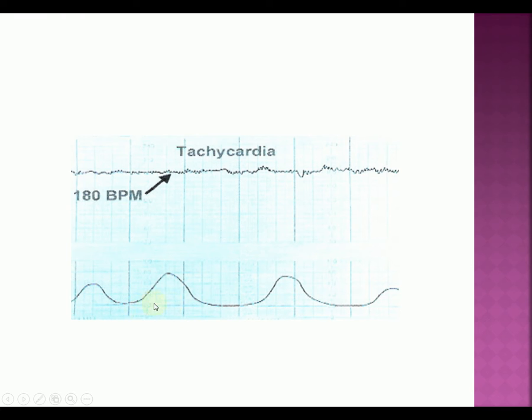The duration, of course, is going to be these little 10-second blocks, which are hard to see in this scenario, but you'll have one that looks better than that. So each one, 10, 20, 30, 40, 50, 60 seconds duration on that one. This one over here is a little wimpy contraction, isn't it? It's like 10, 20, 30, 40 seconds on this one.